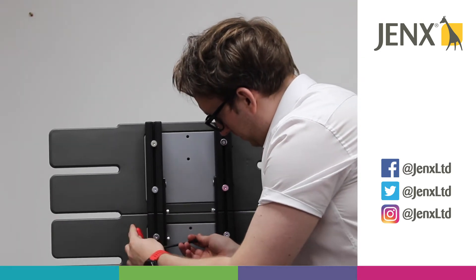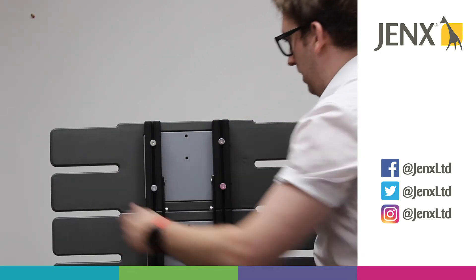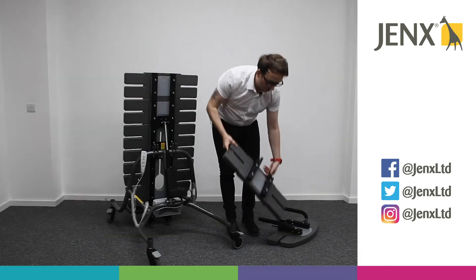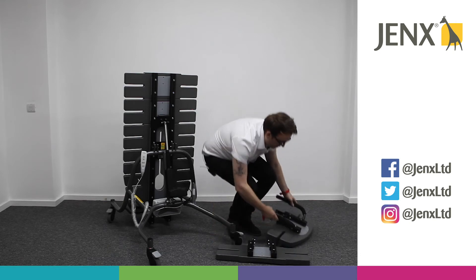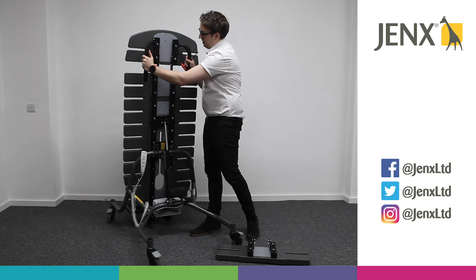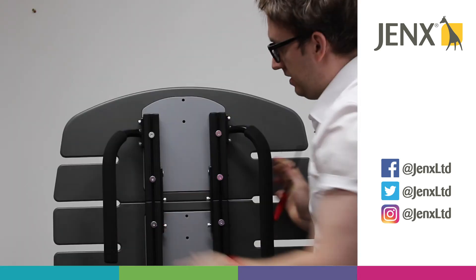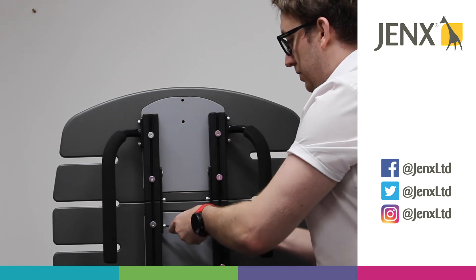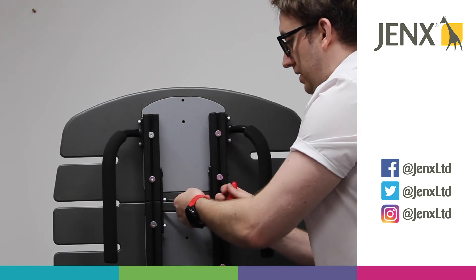Then we can remove the second section. At this point you could choose to put the top section back on for aesthetics — it's entirely up to you. We would just then make sure that all the allen key adjustments are nice and tight.